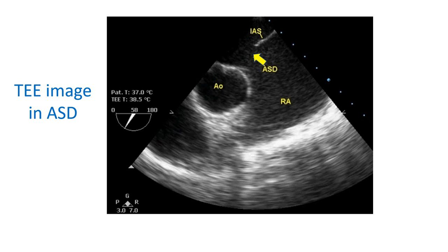Detection of clots in the left atrial appendage prior to planned elective cardioversion for atrial fibrillation is another important role for TEE. Looking for left atrial appendage clots is also important in post-stroke evaluation.